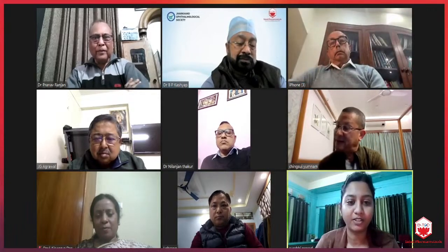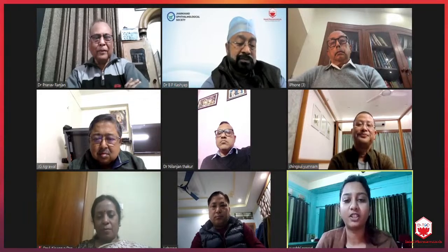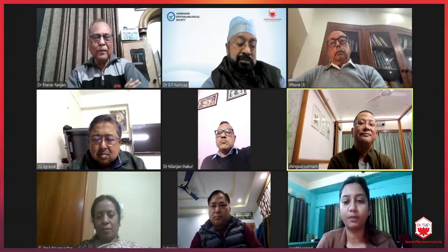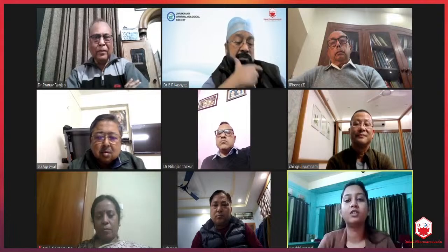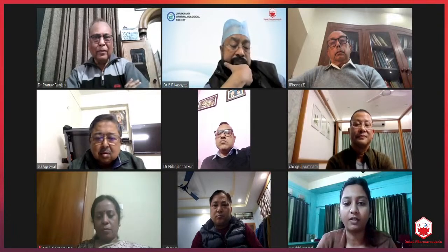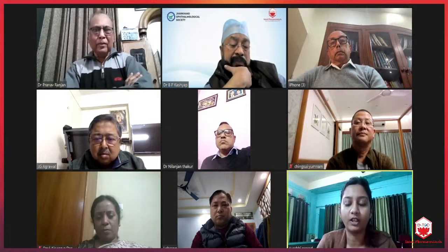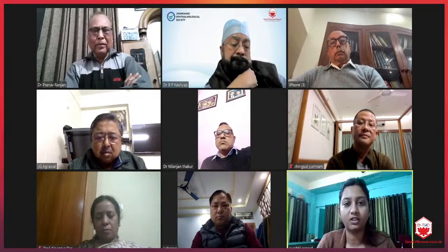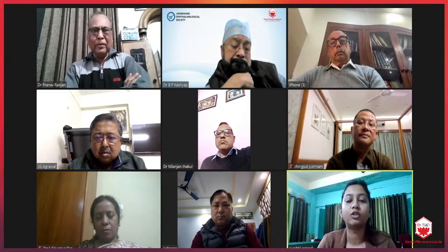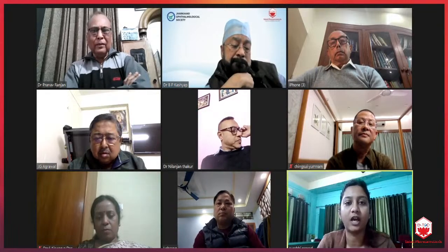Sir, I'm Dr. Surabhi Prasad, PGT from Silchar Medical College. My question is, while doing a triple procedure, cataract surgery with keratoplasty simultaneously, we calculate the IOL power based on the patient's pre-op corneal curvature. But after keratoplasty, the corneal curvature changes. Does this have any effect on the post-op refractive status or the IOL power?